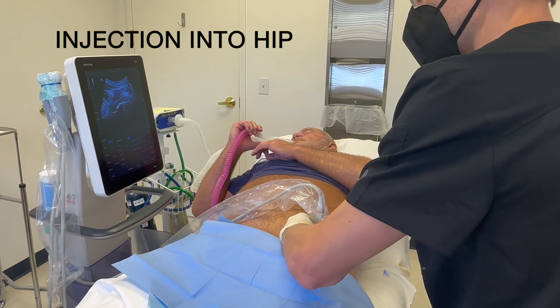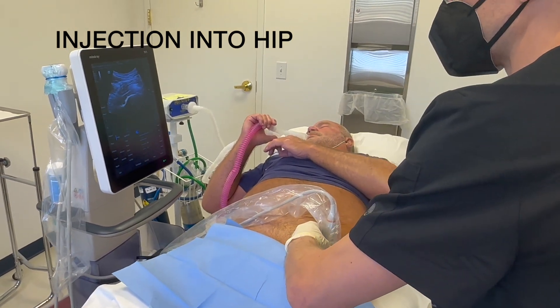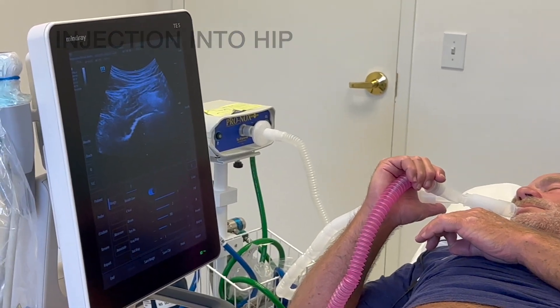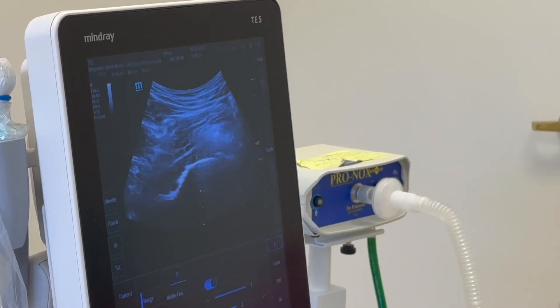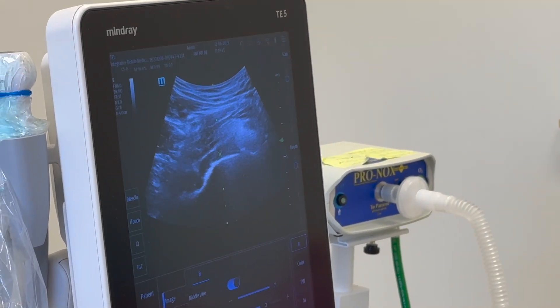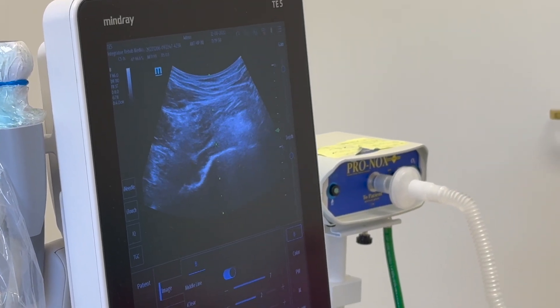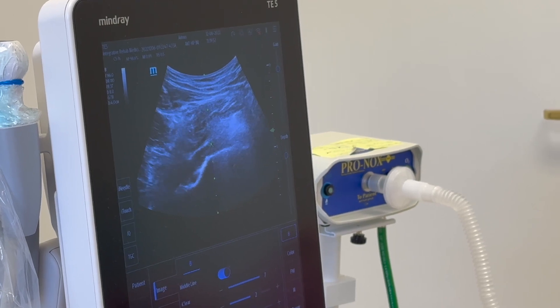You can see there's the hip joint on the ultrasound — we can see a nice view of it. I'm going to go ahead and advance the needle towards the hip joint. You can see the needle going down towards the hip joint. And here we are — we're going to go ahead and inject the bone marrow stem cells now.